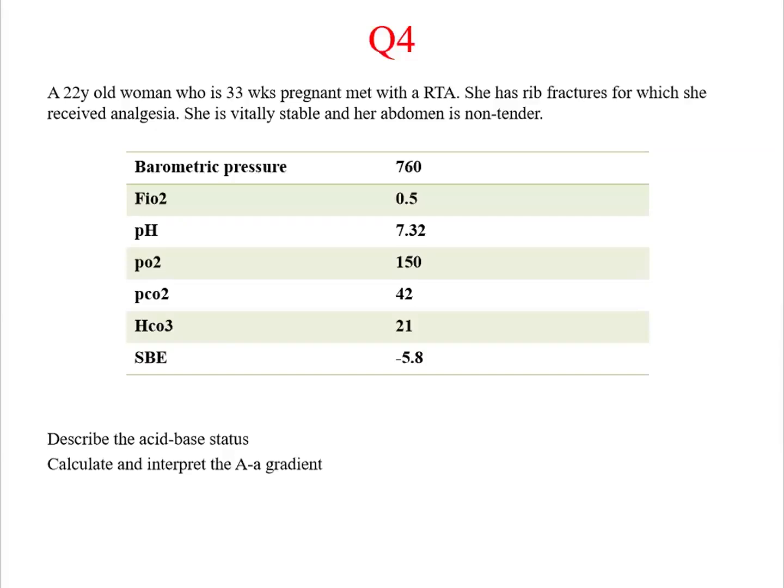Respiratory acidosis with metabolic acid. Okay. So is everyone okay with Mahesh Sinde telling it is a respiratory acidosis? The PCO2 is normal here. What is the PCO2? It is 42. It is normal. Metabolic acidosis, Mohammed.